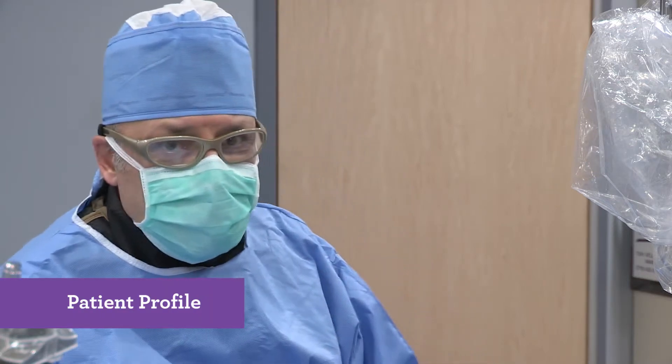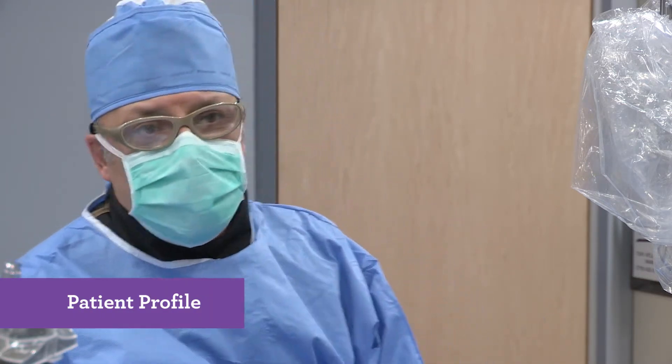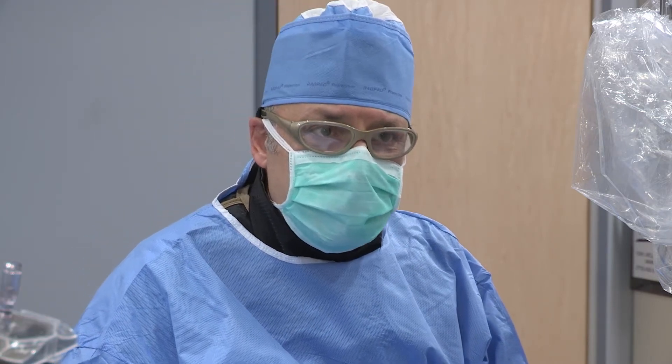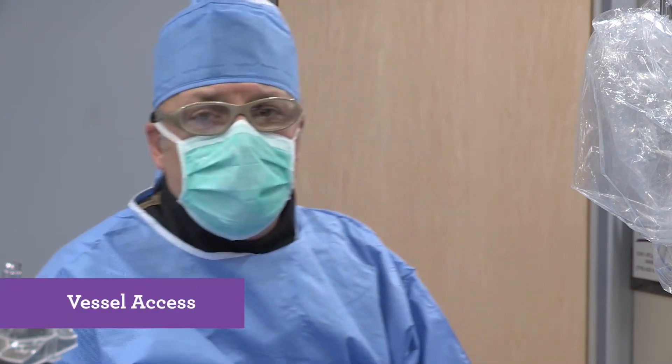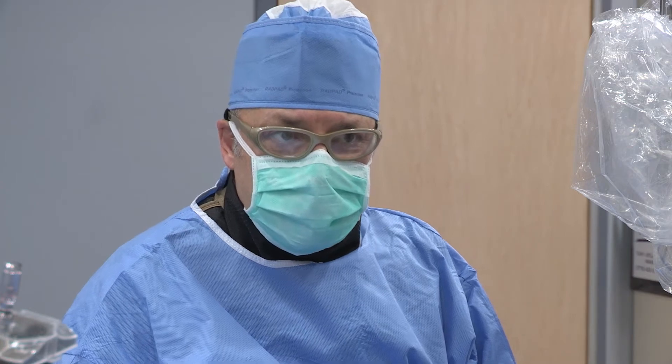Today's first case is a young lady with short-distance intermittent claudication and a history of peripheral vascular occlusive disease and previous stents. We are going to enter the right common femoral artery with the objective of doing an angiogram, followed by angioplasty as necessary.